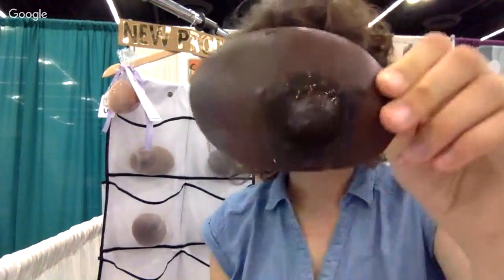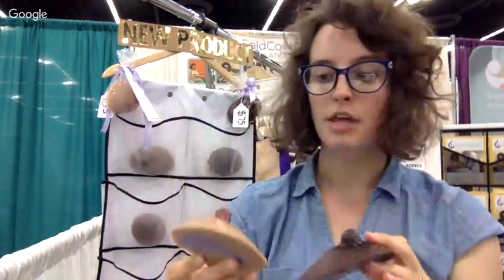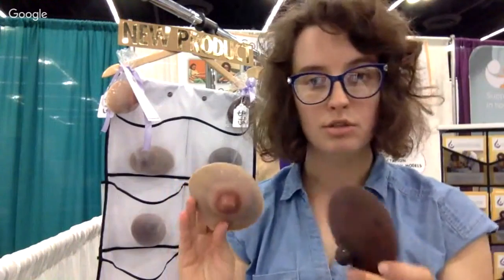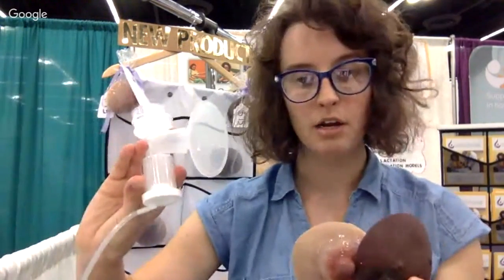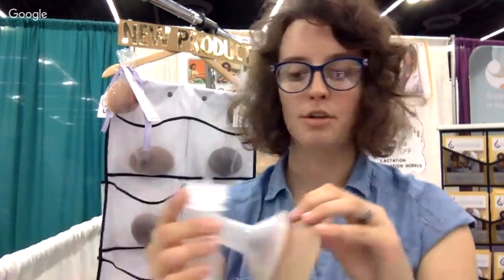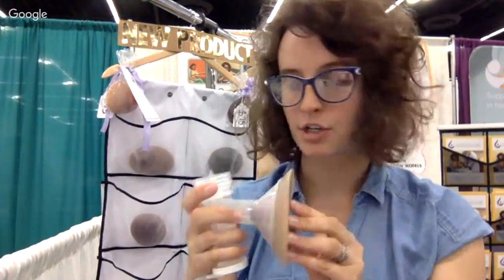We talked about blood blisters and pump flange injuries — different things that are usually related to lactation and incorrect use of things like a pump flange, which is this tool right here. It's attached to a breast pump. And if it is too small, then the nipple is going to come in and rub against this plastic part and cause a friction injury.